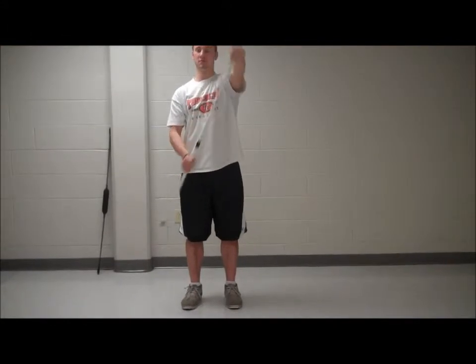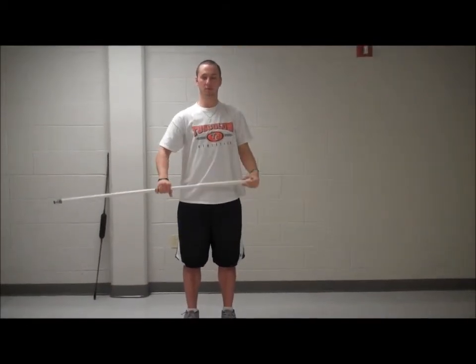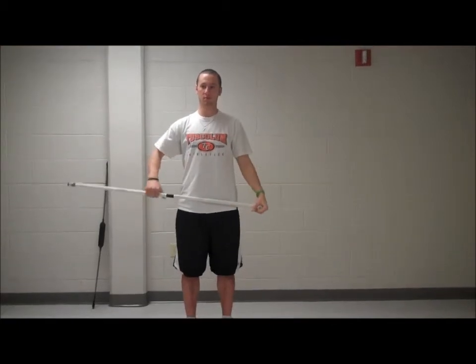T-bar for range of motion. The T-bar can be used to do passive range of motion exercises such as flexion and extension, adduction and abduction in both horizontal and vertical planes, and internal and external rotation.